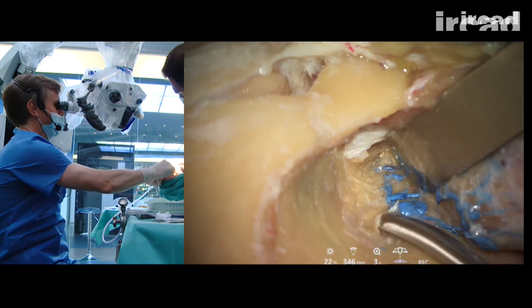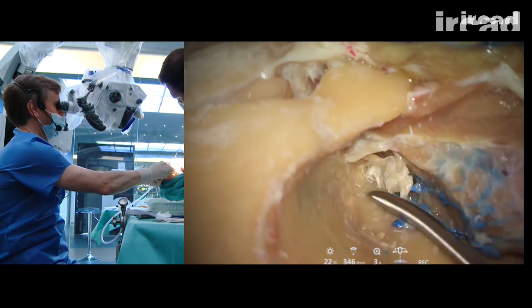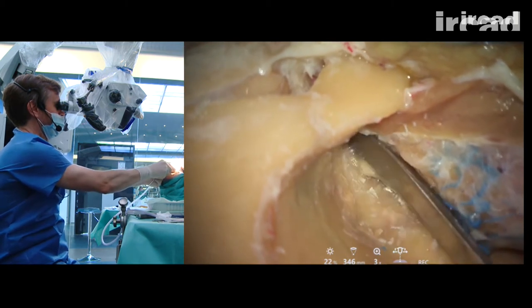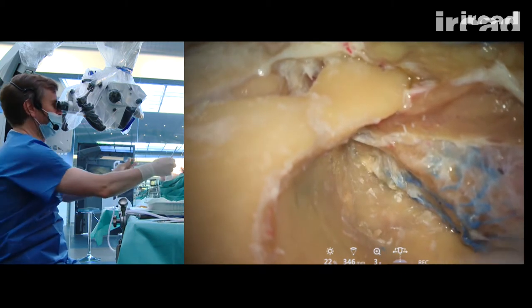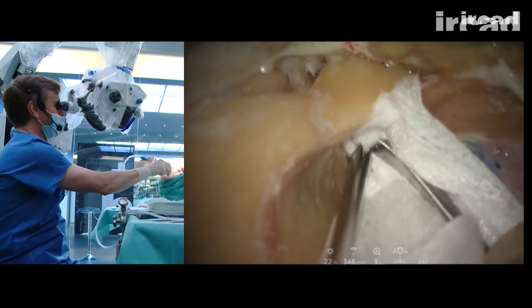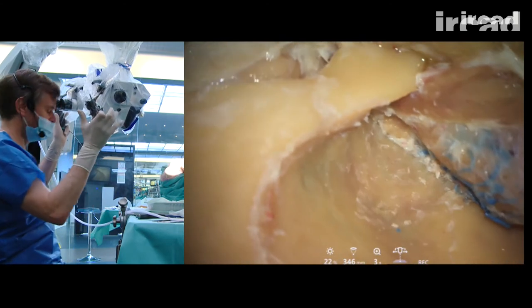So here it's the same. Voilà. I need to keep the periosteum intact. I don't want to leave periosteum on the bone. It's a place where you need to be careful because, again, this is a big trunk of vessel or nerve in this area.